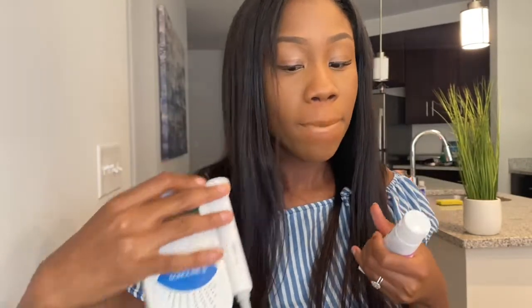Other than that, I would say it's pretty easy if you've been to the doctor before. The process is the same. You lay down and you put the gel on the top of this, and then you put that on your stomach. So like I said, I got this because I thought it would help with my anxiety. I thought, you know, after a miscarriage, this was something that was really a fun and useful tool that allowed me to connect with my baby before I was able to feel any movement, because now I could feel movement, but back then I could not.